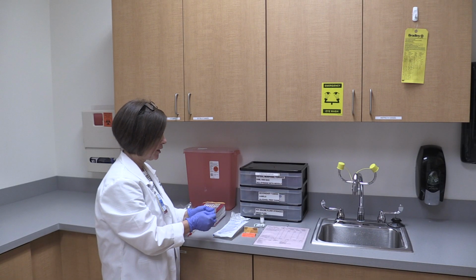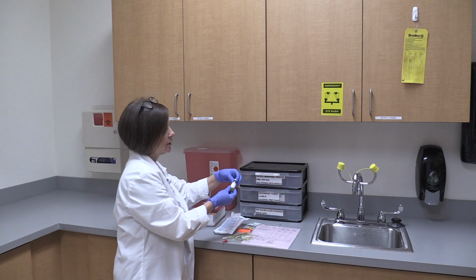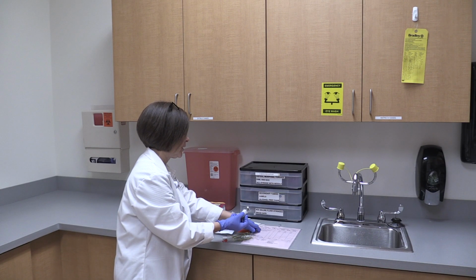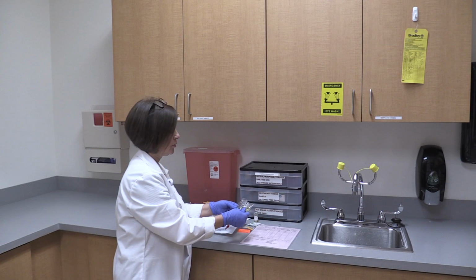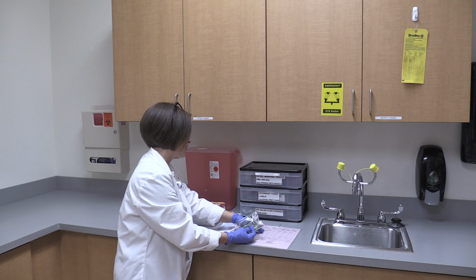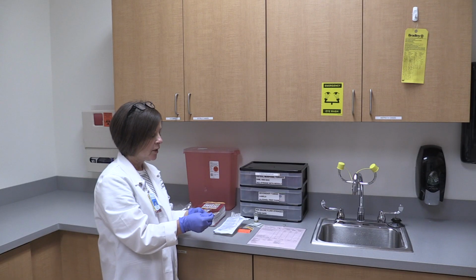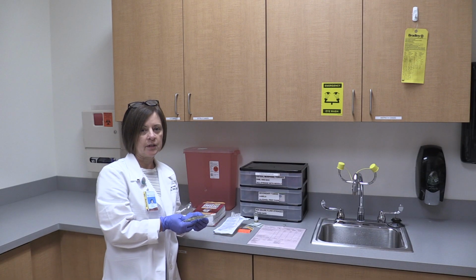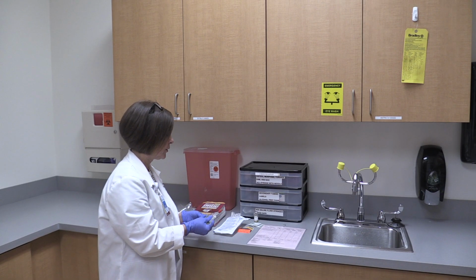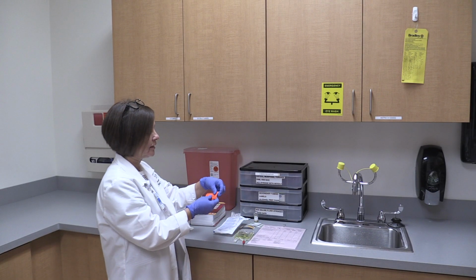So now I'm going to pause and make sure that I have the correct medication. I am using Kefsol cefazolin 250 milligrams per ml, which matches my MAR, and I have put that into 50 mLs of 0.9 normal saline, which is what it says here, and I'll infuse this at 100 mLs an hour, so I'll have to calculate a drip factor. For your skill, we do want you to calculate the drip factor and show us the math that you use to get the rate.